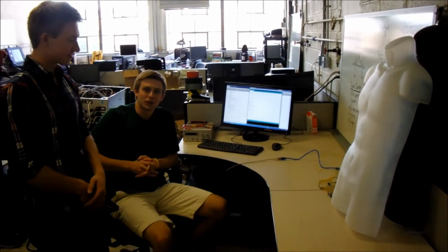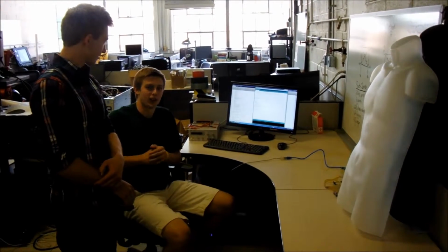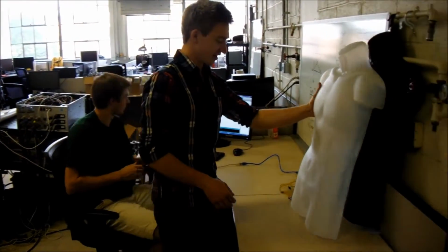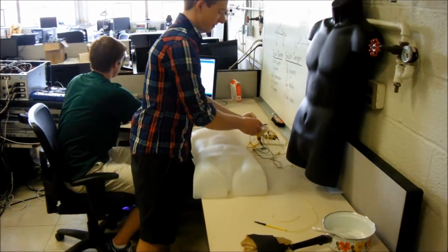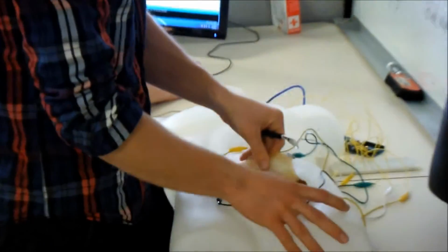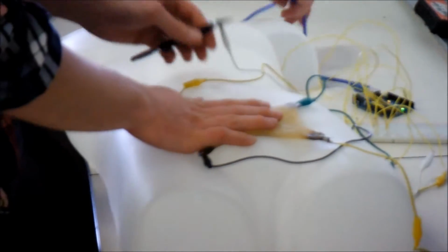This is the demonstration of the ultra-low-cost global health simulator, the general functionality of what it will eventually be. So we have a mannequin here that we're going to put our fake tissue on. This is a fake tissue made of bioplastics. So we put it right here where the C-section would be.